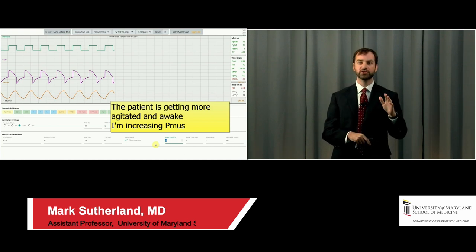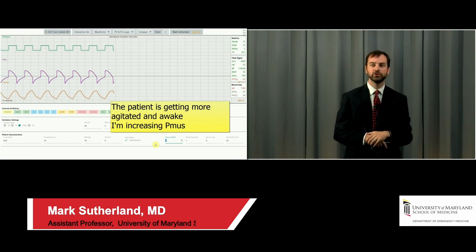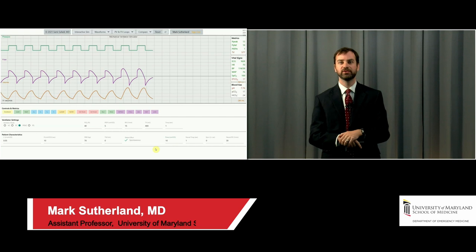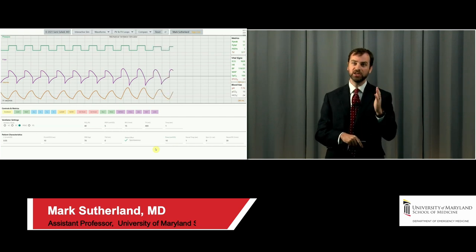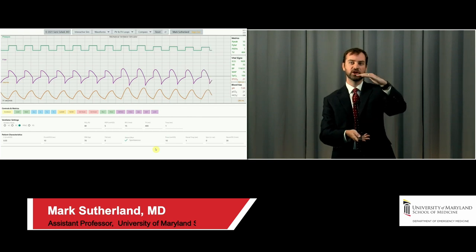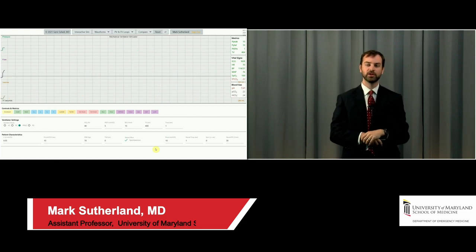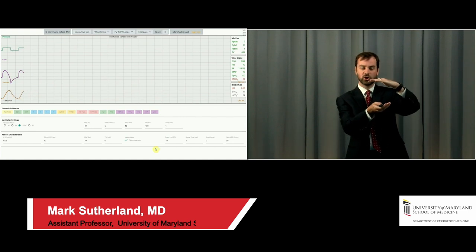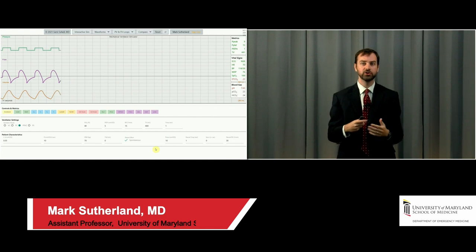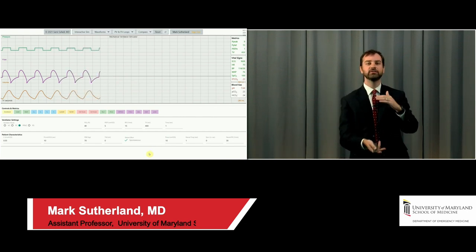And I want you to watch the values on the top right side of your screen there, the values we're getting from the ventilator, the blood gas, the end tidal. Watch what happens, and in particular, watch that P peak in the very top right. What's going to happen is the patient, and you can see the pressure waveforms are shrinking, right? So that top line is our pressure waveform, and those are becoming smaller and smaller because the patient's drawing more tidal volume on their own, and so the machine is saying, well, to maintain the tidal volume I'm supposed to have, I need to give less pressure.